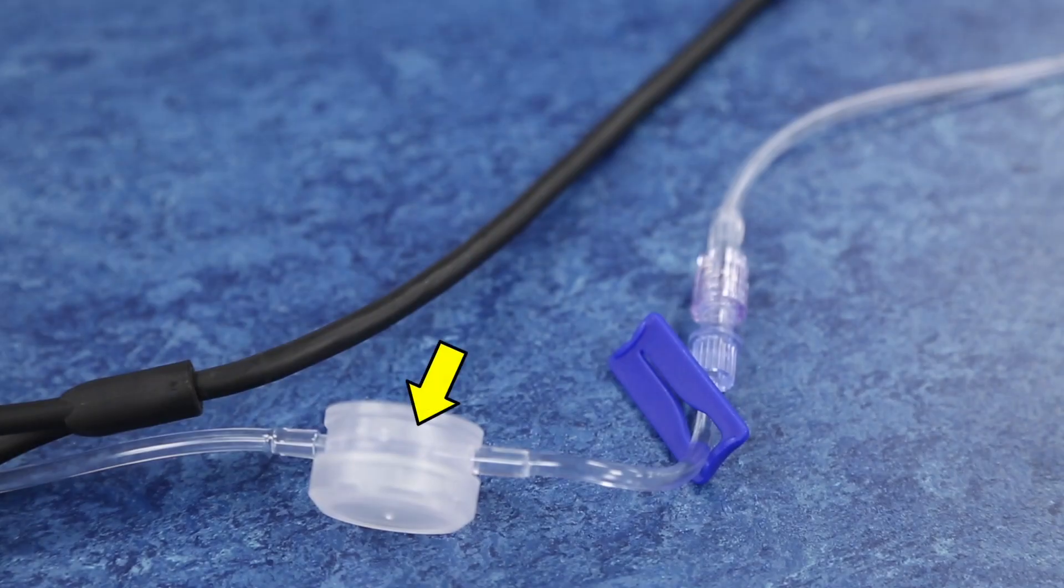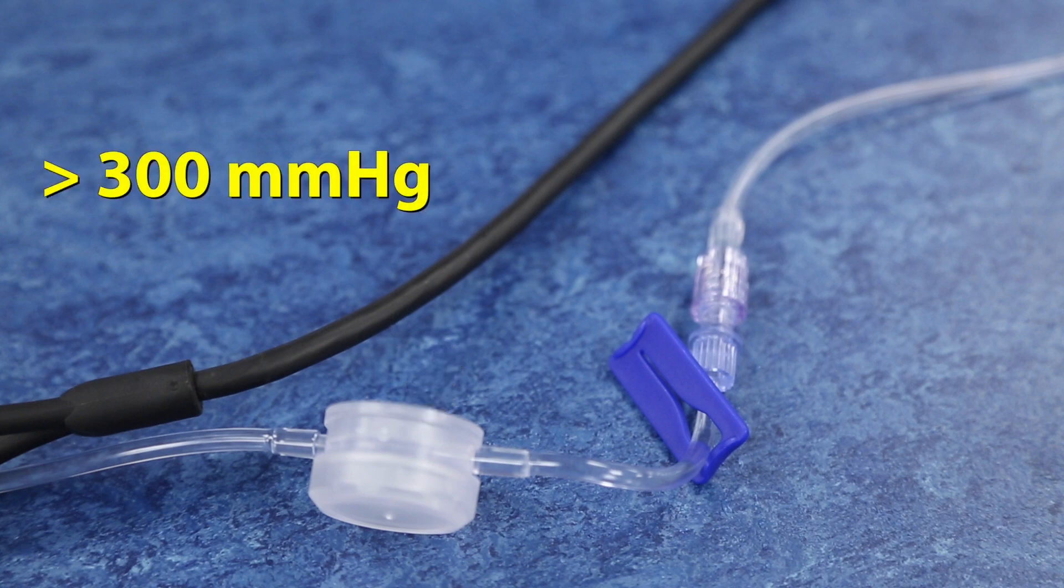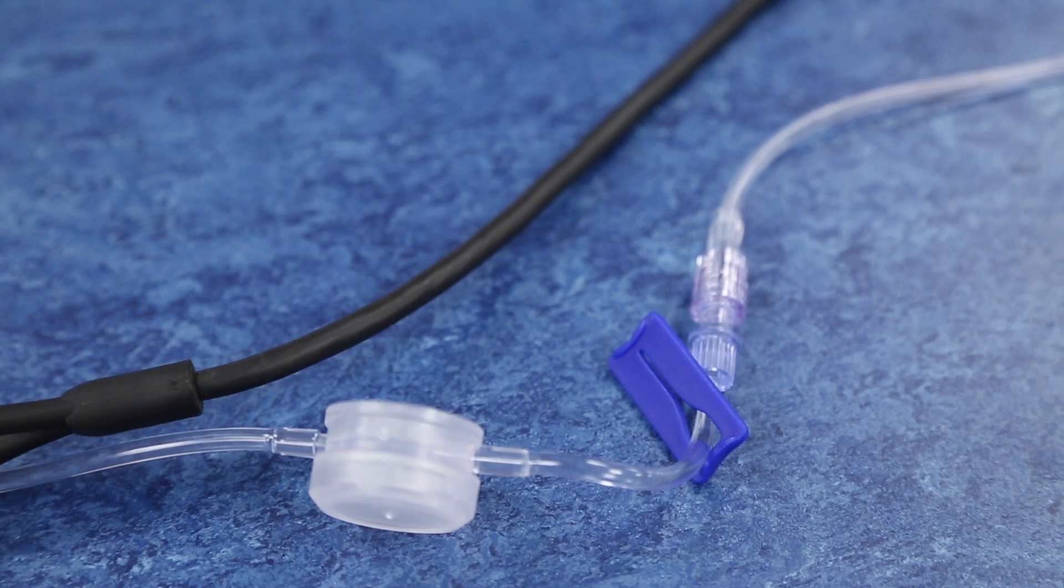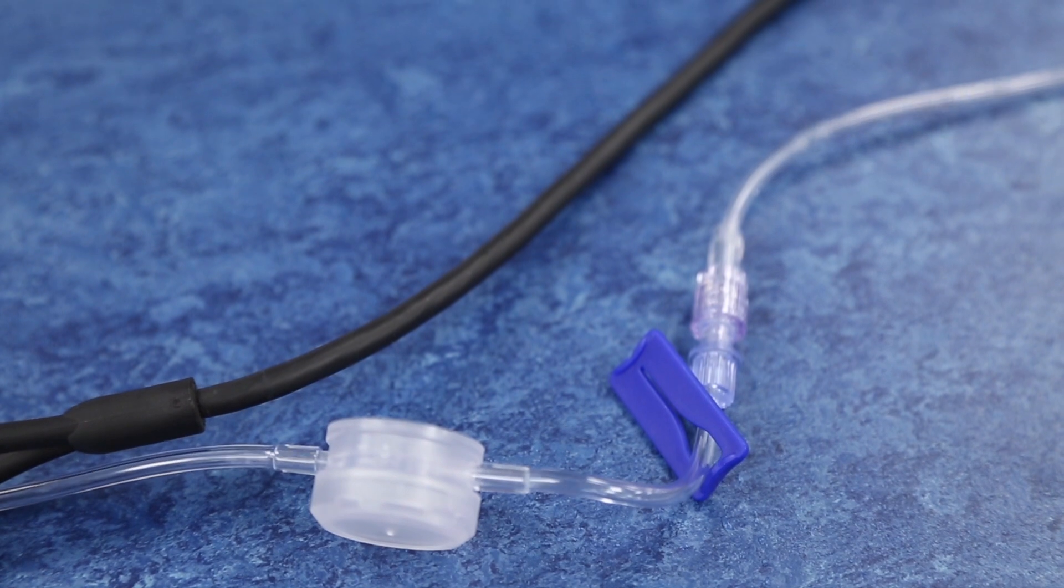A pressure regulating valve prevents abnormally high pressure greater than 300 millimeters of mercury from reaching the set or the patient. If pressure exceeds 300 millimeters of mercury, the flow of fluid will stop. Flow will continue when pressure is reduced to a safe level.